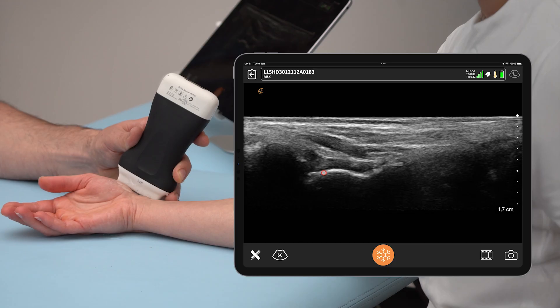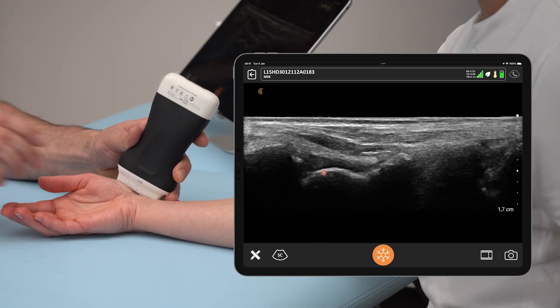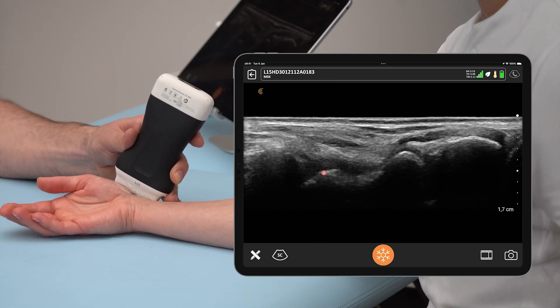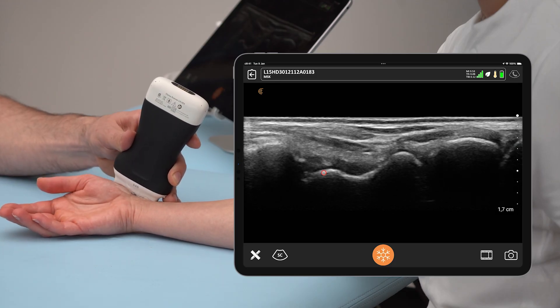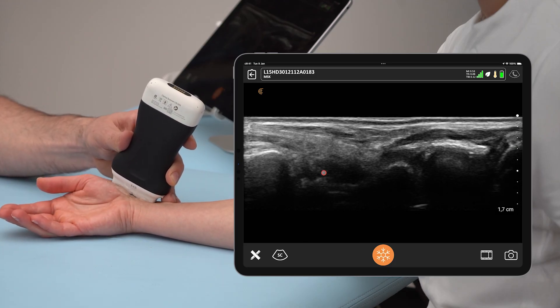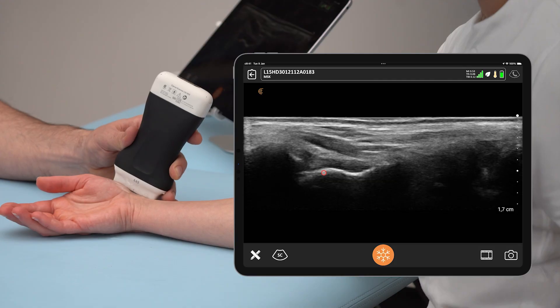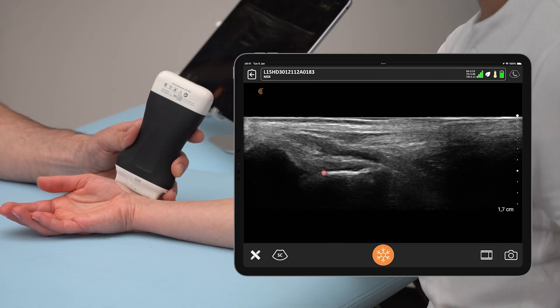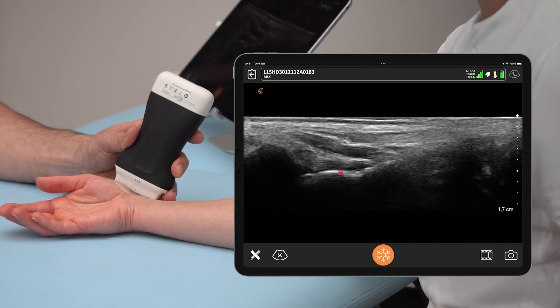Always check for any cortical irregularities, and make sure to slide with the transducer from medial to lateral to see more of the cortical surface.